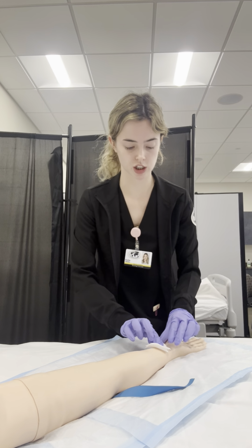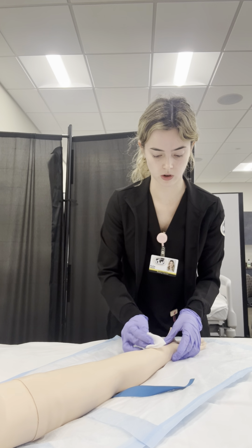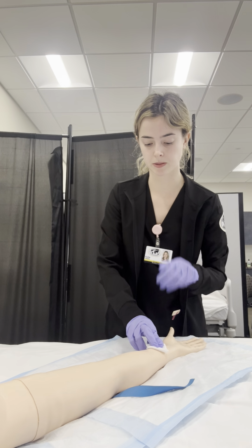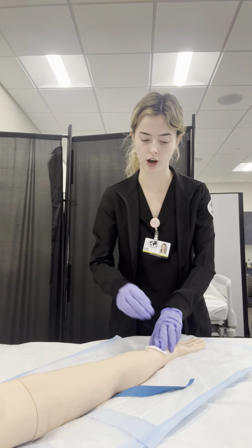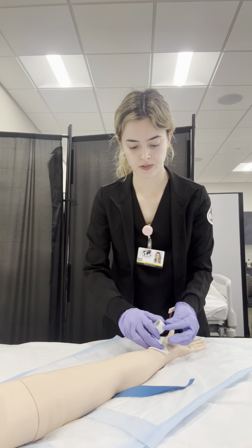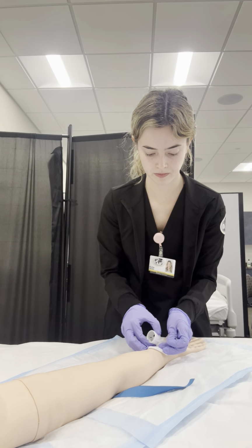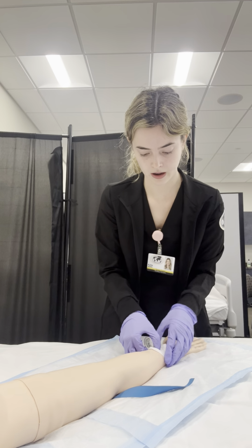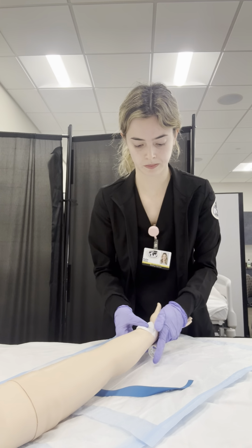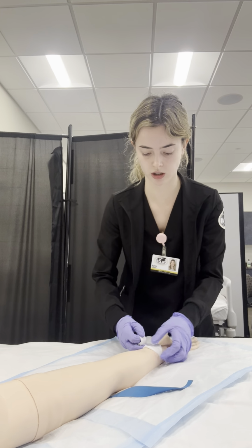Then I'm going to look at the insertion site again. No signs of infiltrations or hematoma. All looks good. I would ask the patient, are you experiencing any discomfort or pain? They state no. So now I want to apply a pressure dressing. So I'm going to leave the gauze on the arm and apply a pressure dressing. So this is to ensure firm pressure on the IV site.